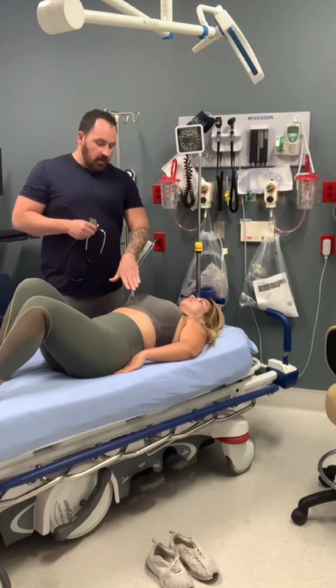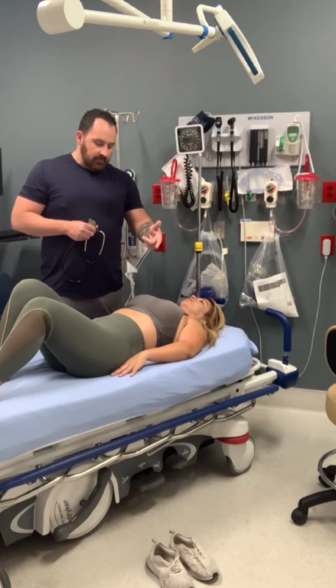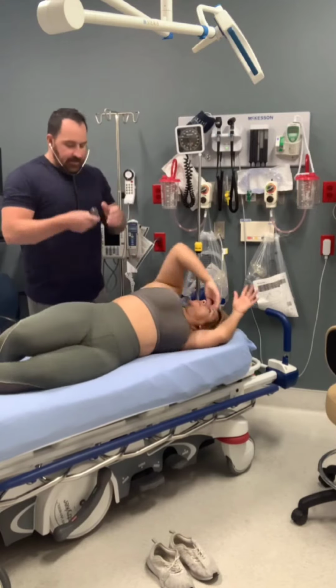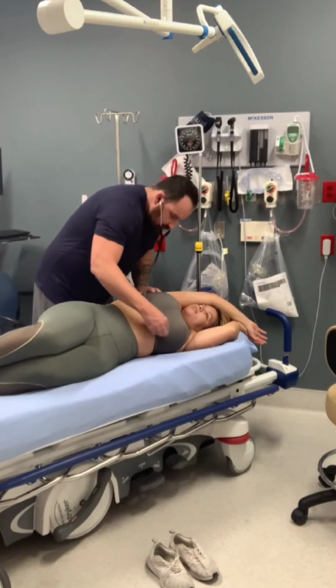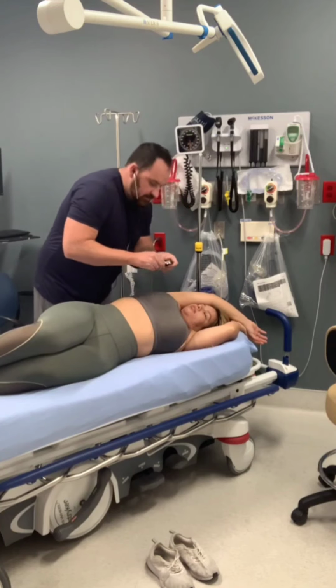This area is better to hear mitral valve and tricuspid valve murmurs, such as tricuspid insufficiency, mitral valve regurgitation, or tricuspid regurgitation. What I'm also going to get you to do, if you can, is roll that way to the left side. And again, I'm going to listen with the diaphragm. And then I'm listening with the bell.